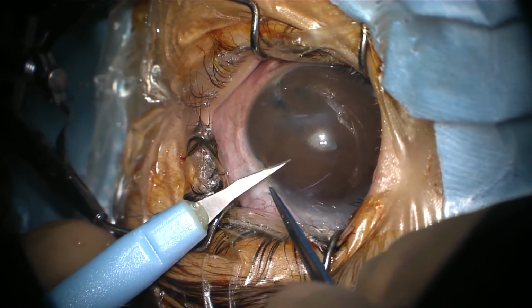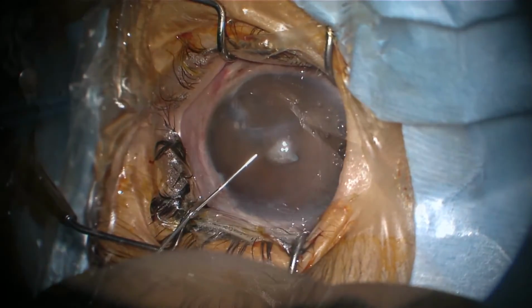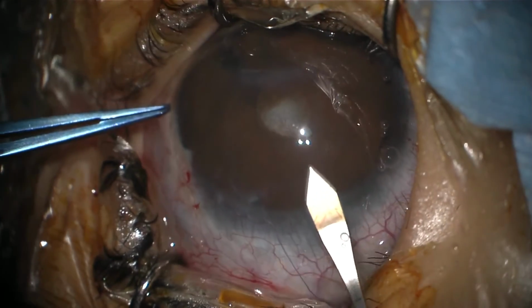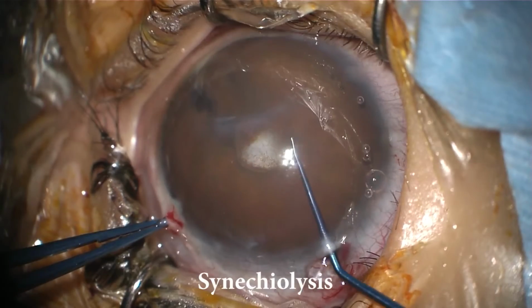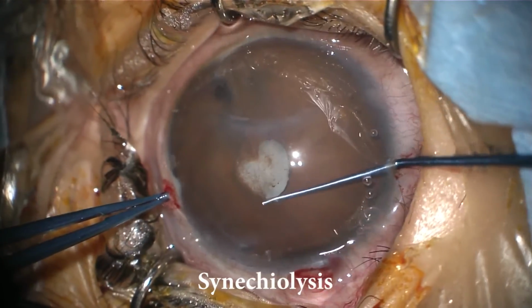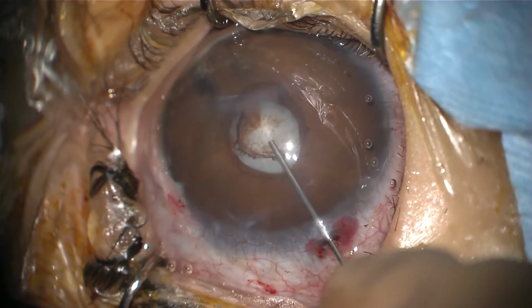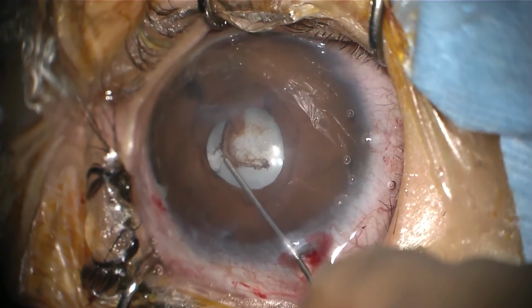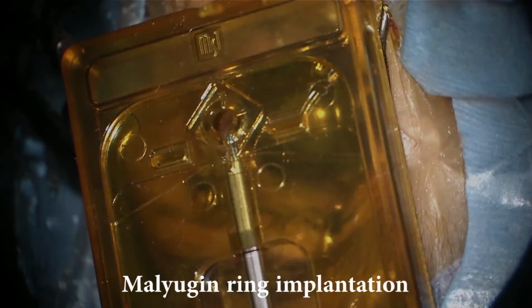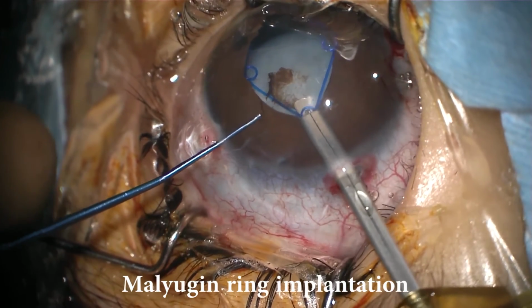The left eye was taken up for surgery under general anesthesia and full aseptic precautions. Limbal incisions were carefully placed, accounting for the stretched out limbus. Synechiolysis was done to break the iridocapsular adhesions and free the pupillary margin. A Malyugin ring was used to maintain adequate pupillary dilatation during the surgery.